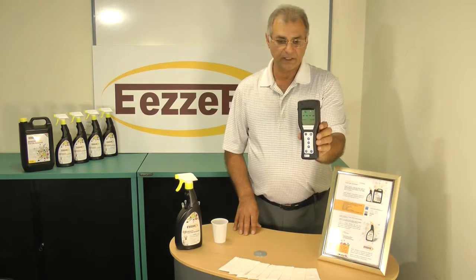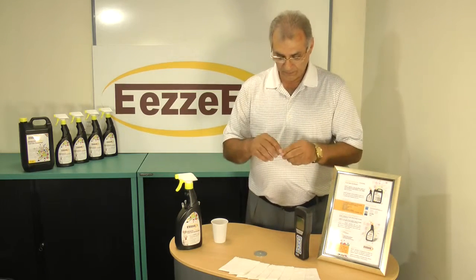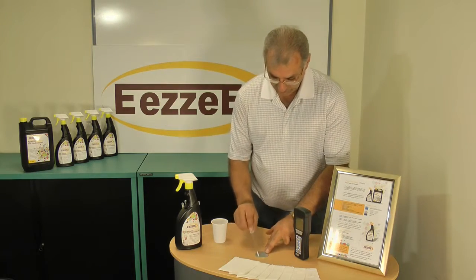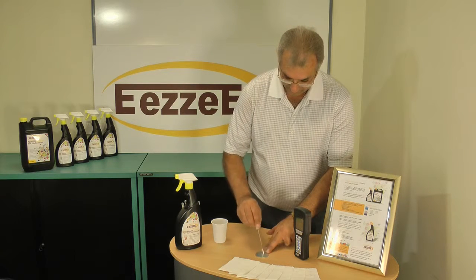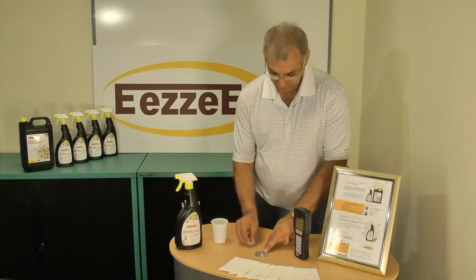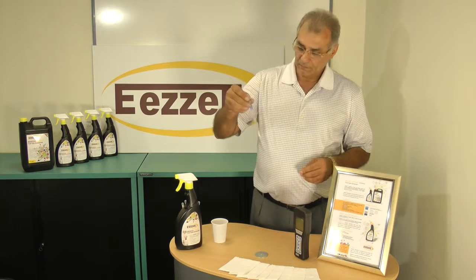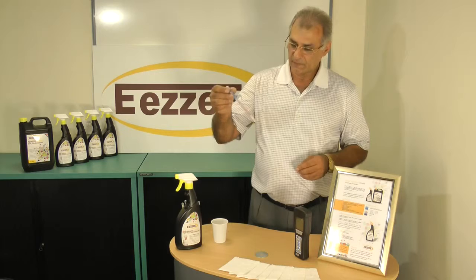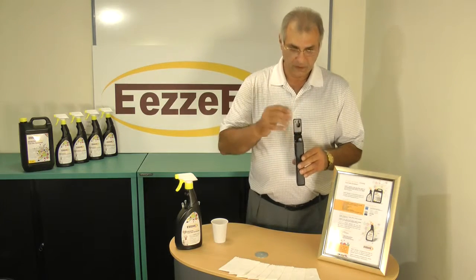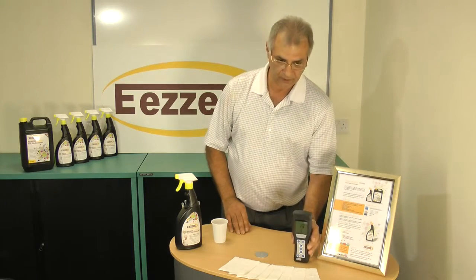The machine is now ready. It is set to zero, and we take the swab test. This is the swab that is used particularly for this machine, and we take a swab of this surface which has been infected. Then we insert the swab into the machine and press OK to start counting the bacteria level.